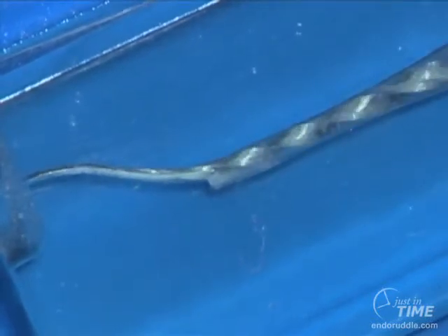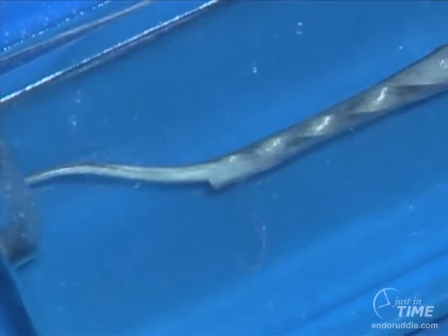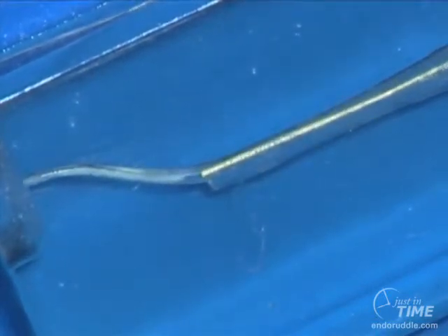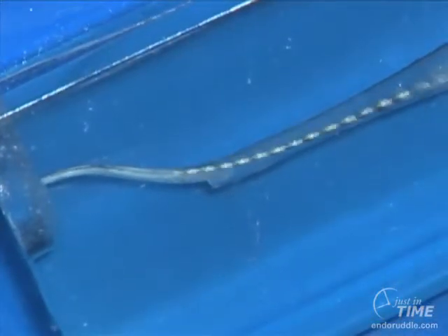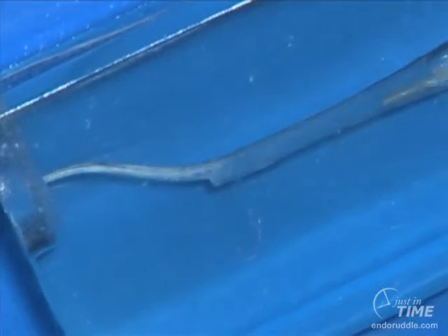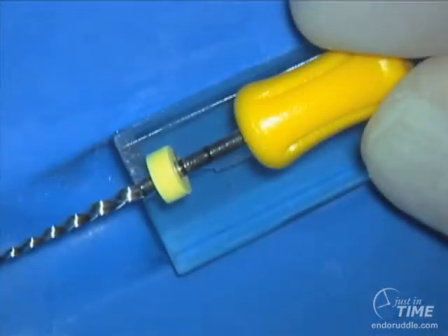In this case, we work the ProTaper S2 until we reach length. Notice that we are expanding the shape, and as we expand the shape, we're minimizing the ledge, but the ledge is still present, and it's still an impediment to sliding smoothly through the canal to the terminus. We must irrigate frequently during these procedures as we're generating debris.